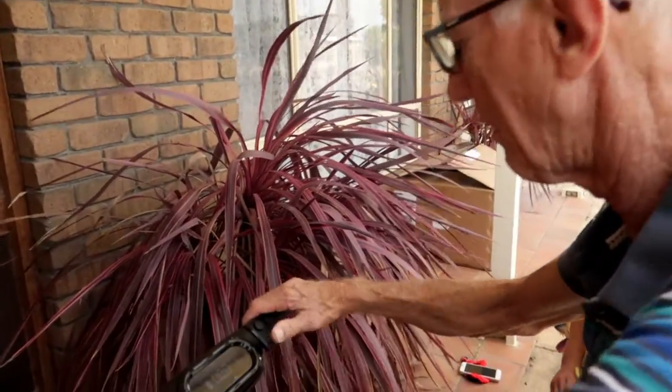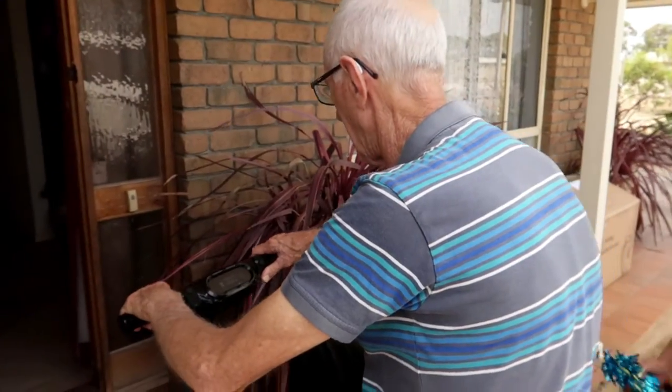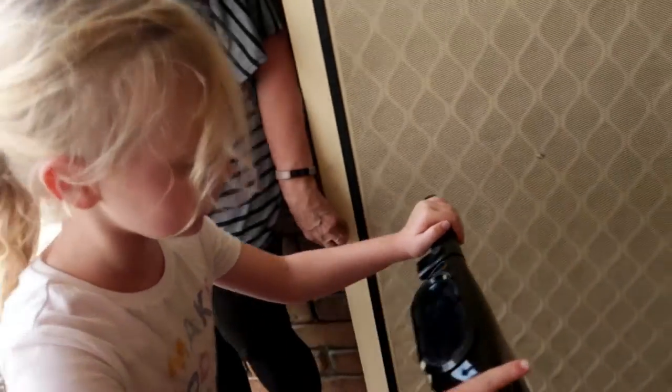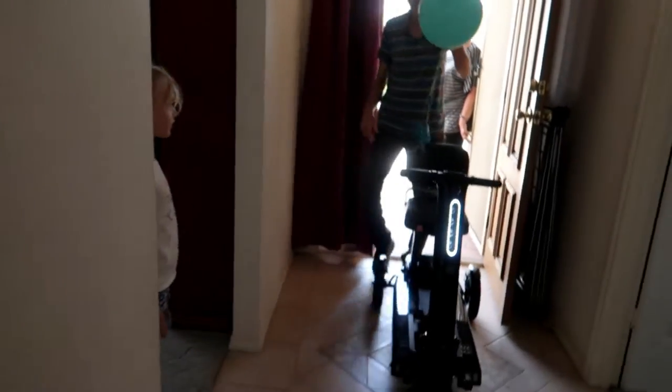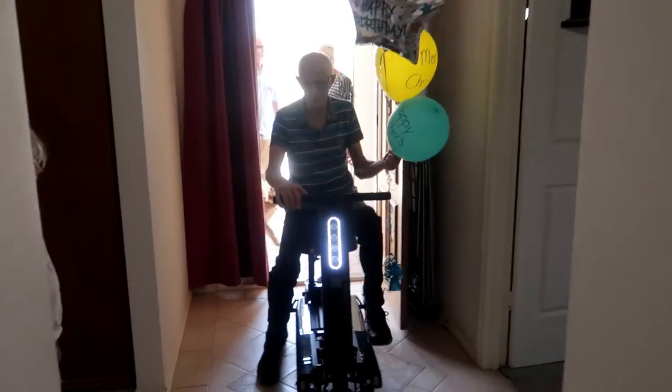Pearly, show Pa how to get it up into his house. We wanted to help you be mobile. Let Pa hop on — are you ready? Oh my goodness, it's gorgeous!